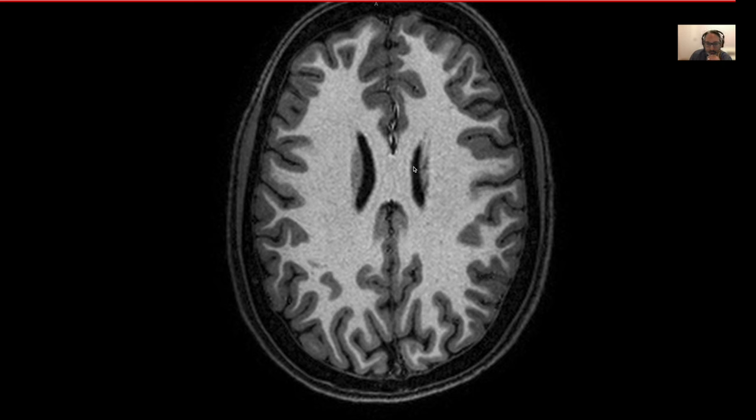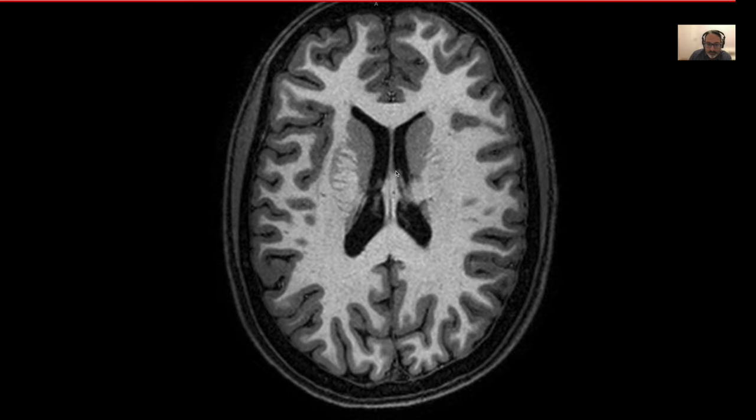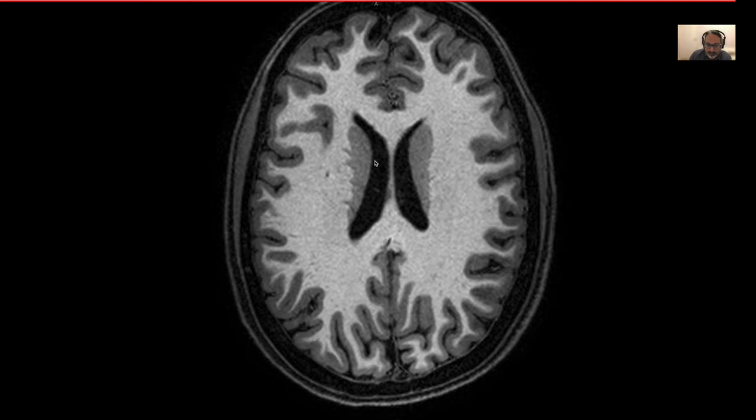So now as you go lower, you see more white matter. You see the ventricles, the lateral ventricles, and you see the corpus callosum. Now as we go further inferiorly, let's keep going further down. The ventricles get bigger. Now let's see, these are the ventricles again. So that's your anterior horn. The occipital horn is coming in.